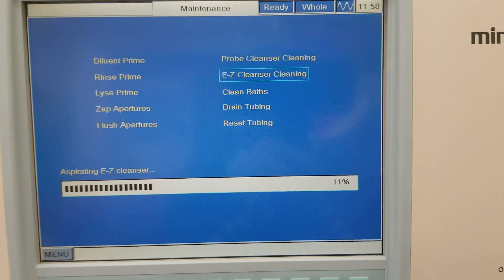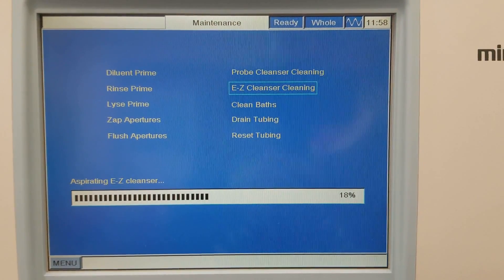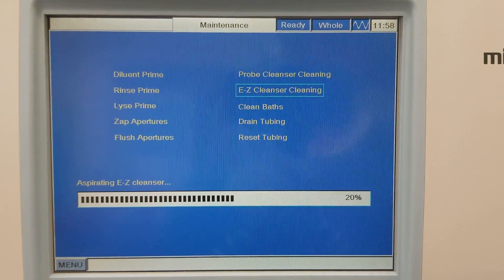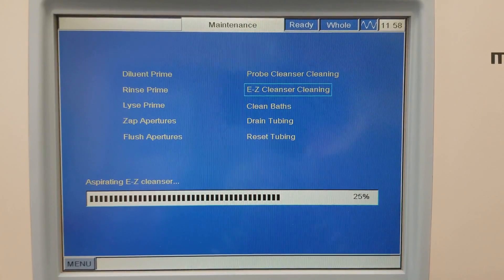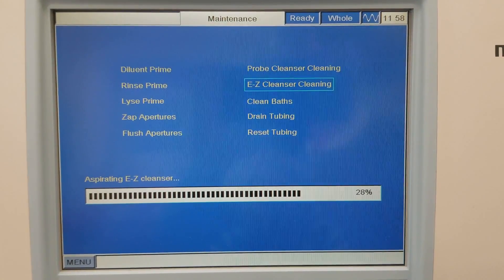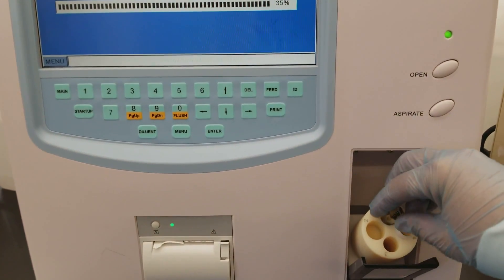At the beginning of class you should do the probe cleanser cleaning — do that as soon as you get into the classroom so that your analyzer is ready for your specimens. At the end of class, when everybody is done using the analyzer, you're going to use the Easy Cleanser and perform that cleaning.